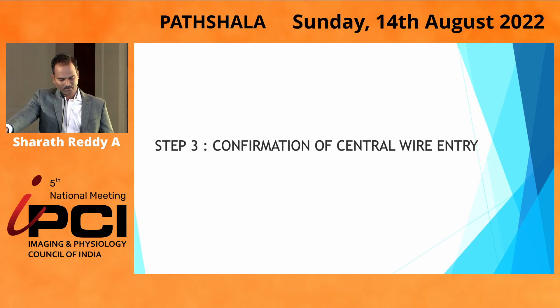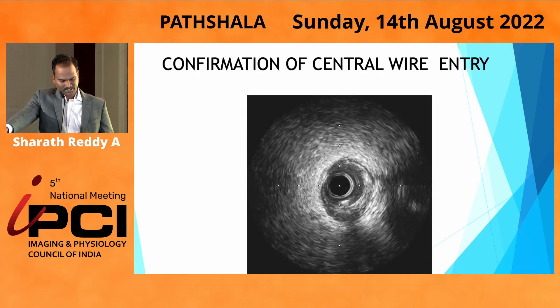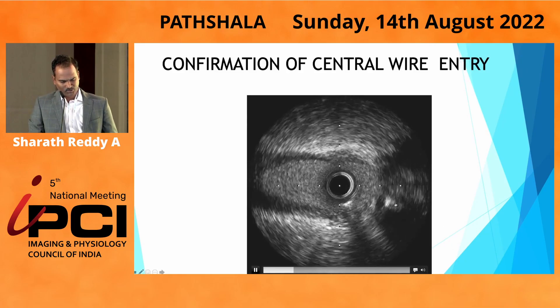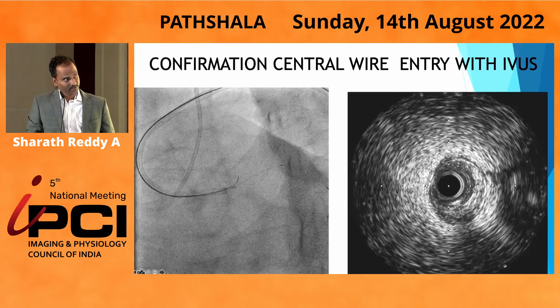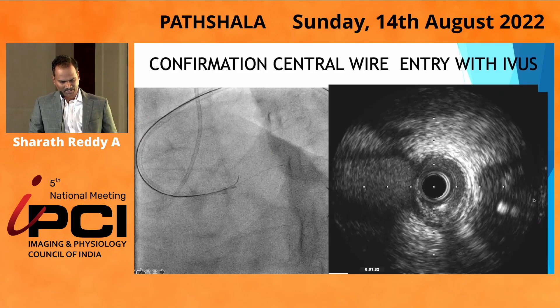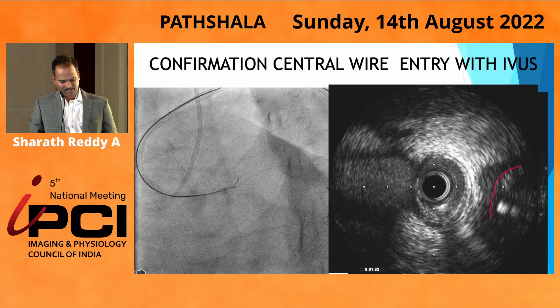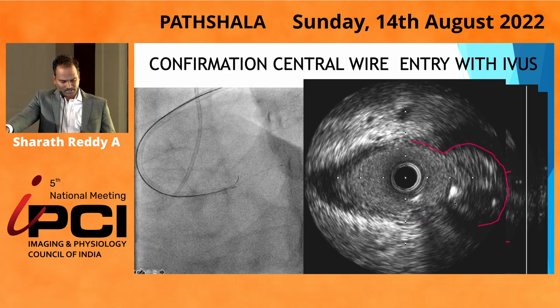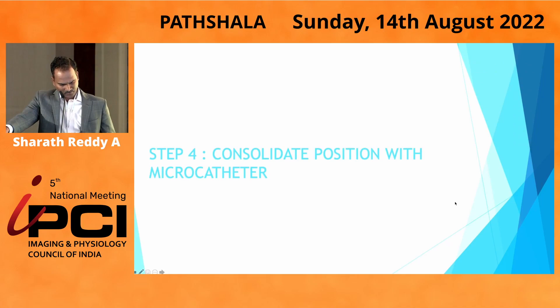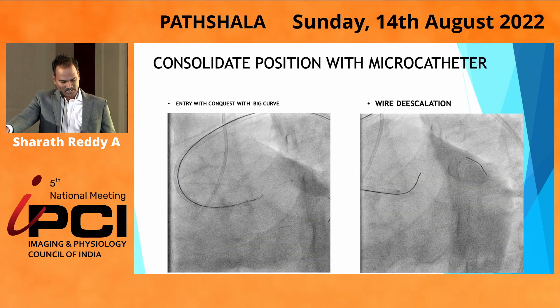Once you enter the cap, confirm with IVUS. You can see the wire shadow — it should be within the media in all views. Here you can see the wire and the limit of the media — wire within the media, confirmed again in another view. You confirm it by IVUS, then consolidate your position by sending a microcatheter into the proximal cap, de-escalate the wire, and move on.